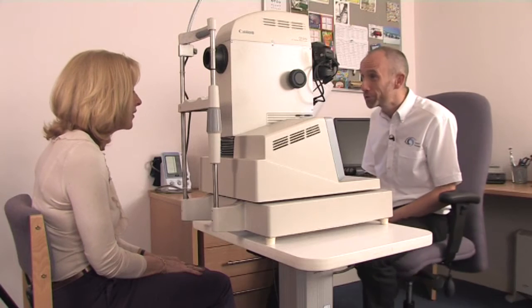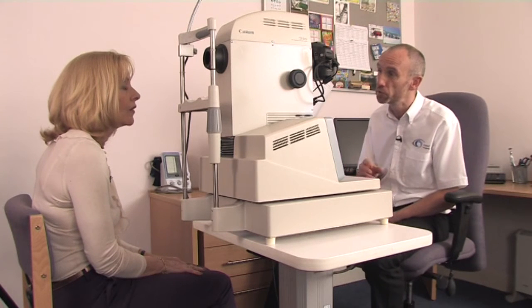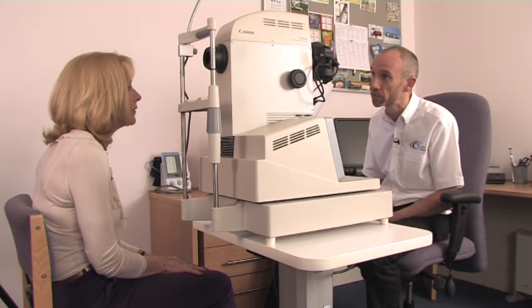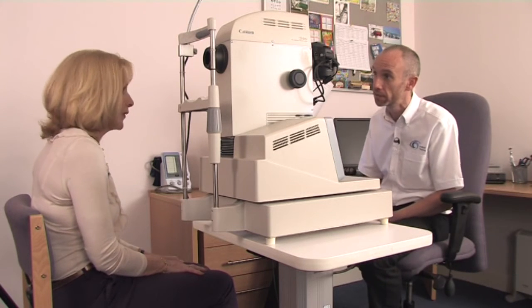What's going to happen? Well, what we're going to do is ask you to sit in front of the camera, and I'm going to attempt to take two views of the back of each eye — two standard views. All I need you to do is just follow a target. You'll notice a bright flash when the camera fires, so that might just blur your vision for a few seconds. Right, I'm ready.